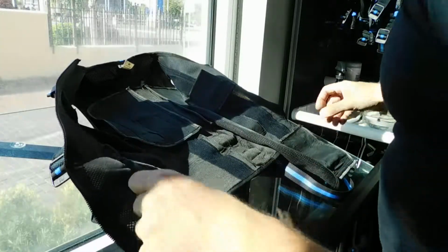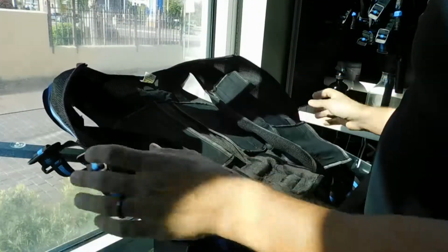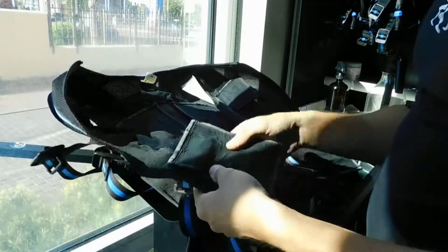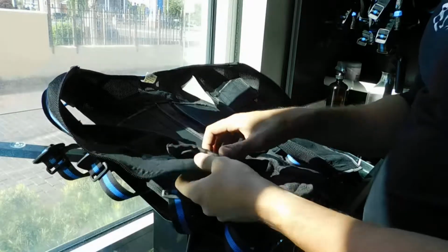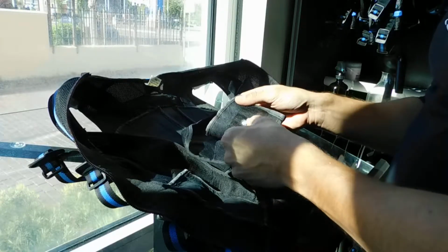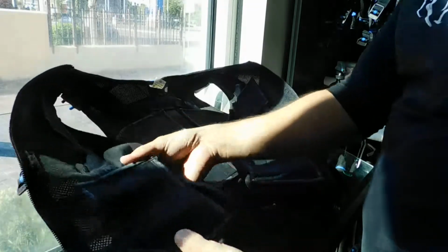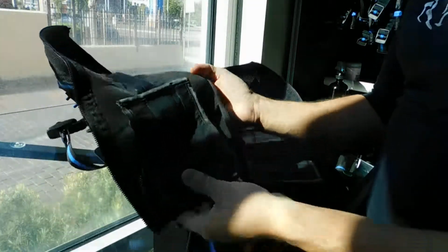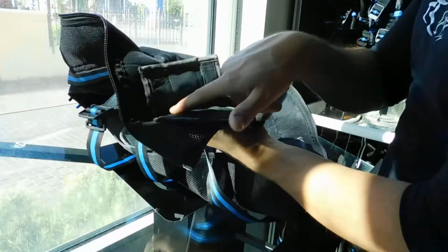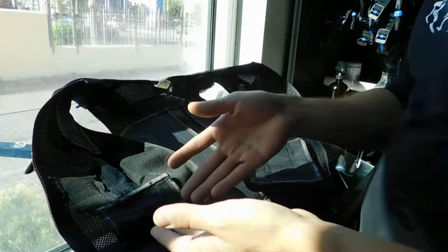So let's say the ab's not working. It could be multiple things. In most cases, it's actually not the electrode itself, but the cable behind it. For example, when they do crunches, because this hasn't been moved for a while, when they crunch, it creates this gap. Do you see this? Like let's say I crunch, now there is this gap where it's not touching me. So it can cut out and feels not constant just because it has that gap.